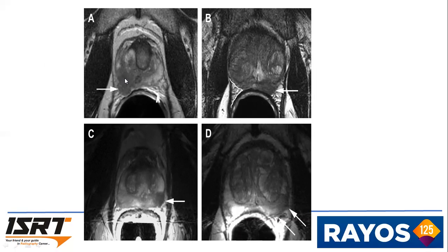Here we can see a lesion here. Here we can see a lesion. Here also we can see a lesion.